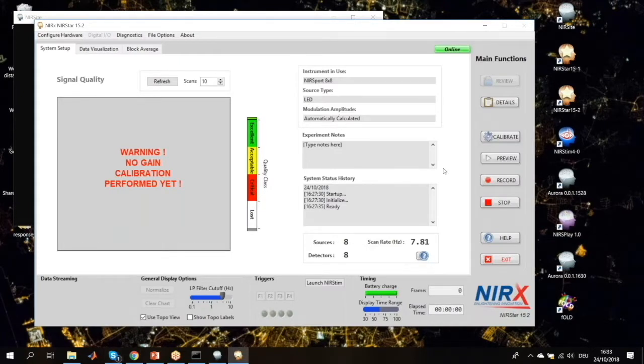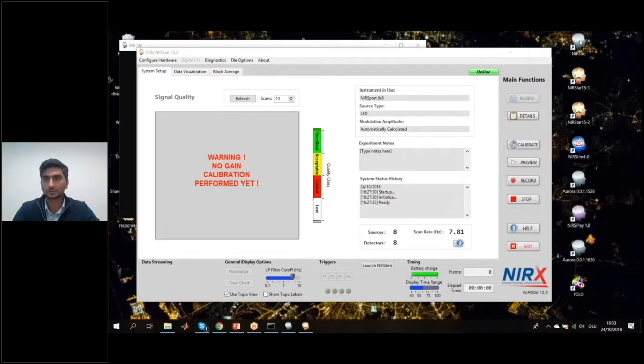In this part, I will share my webcam and I will try to show you the placement of headband. Let me find it. It's here, everybody can see now. So I take my headband, which is already prepared. You can see here I have 8 of my short detector clips placed around 8 of my sources. So 3 on top, 2 in the middle, and again 3 in the bottom row.